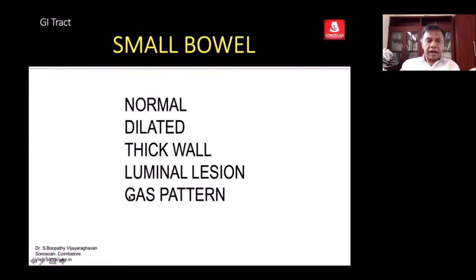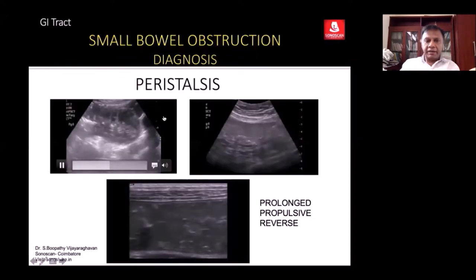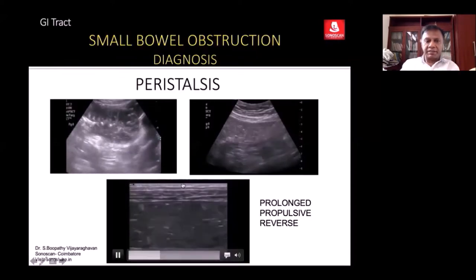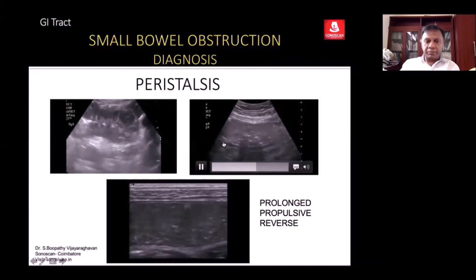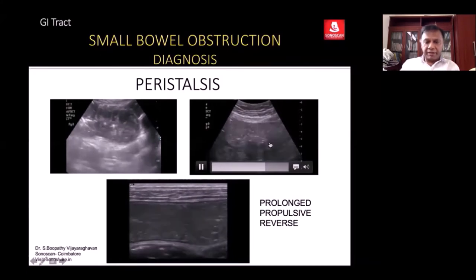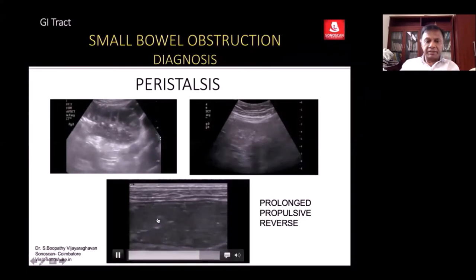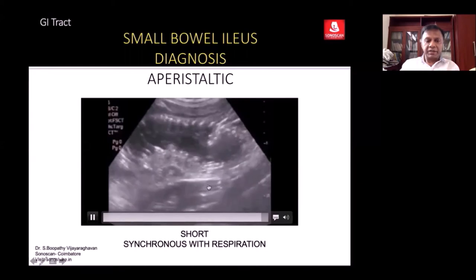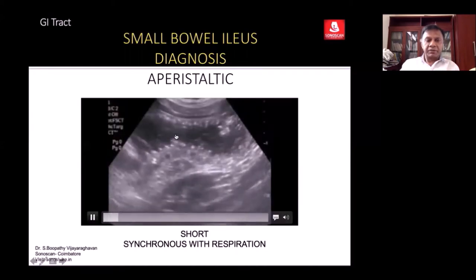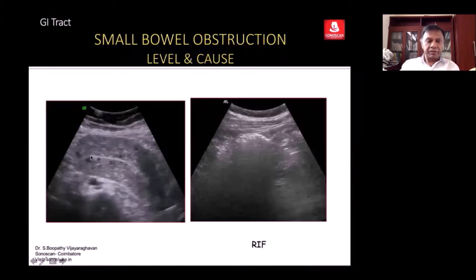There may be an abnormal gas pattern. Active peristalsis is prolonged, propulsive, and vigorous. In contrast, bowel movement that is not peristalsis is short and synchronous with respiration — that differentiates the two. If you are diagnosing obstructed dilated loops, go to the right iliac fossa as the next step.